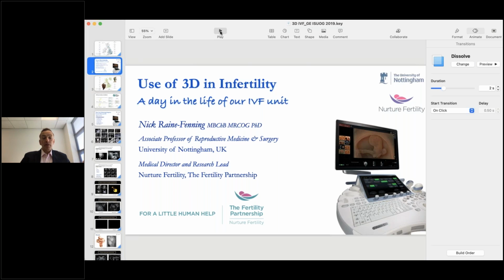So let's begin with pre-treatment assessment, and this has got relevance for all of you. Now, I show this slide quite a lot. It's just a brief summary of some of the things we can find. Now, I'm still amazed at really how little we know about all of these different pathologies. So we've got a variety of things you can see here: uterine abnormalities, endometrial polyps, cysts, ovarian cysts. We've got hemorrhagic cysts here, endometriomas. And then there's hydrosalpinx there you can see as well.